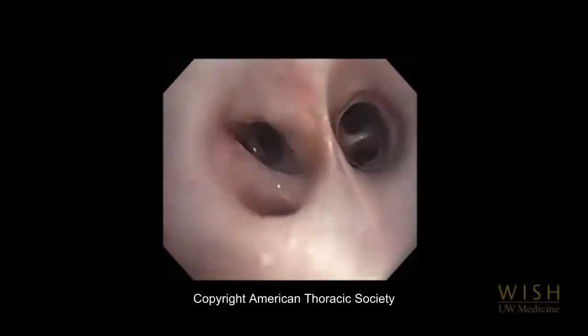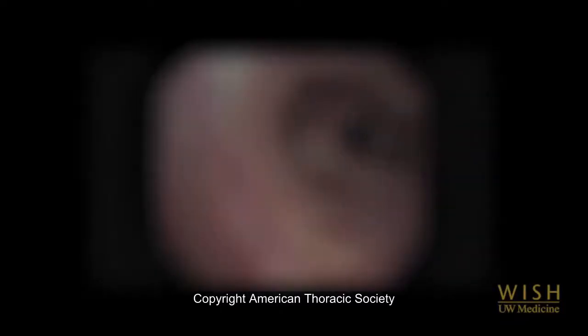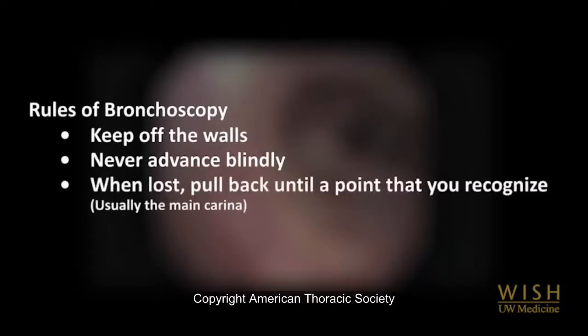There are a number of normal variations in the anatomy of the airways. You will become familiar with these as you practice. In this presentation, we have demonstrated the most common airway anatomy and illustrated the rules of bronchoscopy. Keep off the walls, never advance blindly. When lost, pull back until the point that you recognize. Use medications to reduce cough.